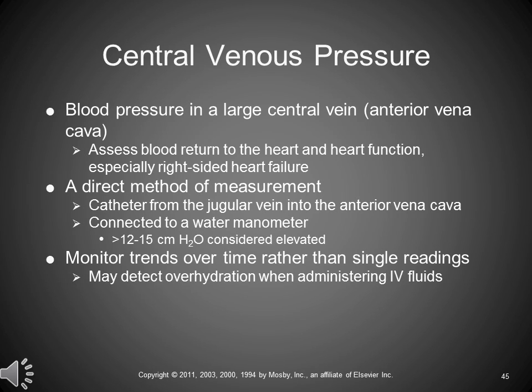It can tell you if the patient is hypofluidized. I guess there's not a word for that. If they're receiving too little or too much fluids. Okay. If the CVP goes down too far, they need more fluids. If the CVP goes up too high, they're getting too many. And it's a great way of preventing overhydration or underhydration, especially of shocky or of very sick patients.